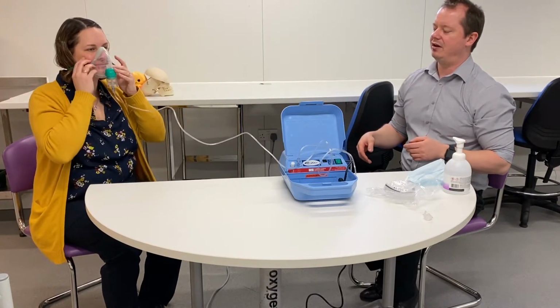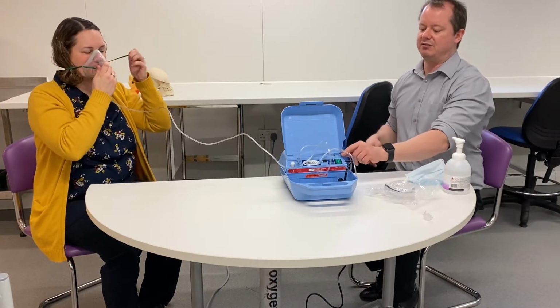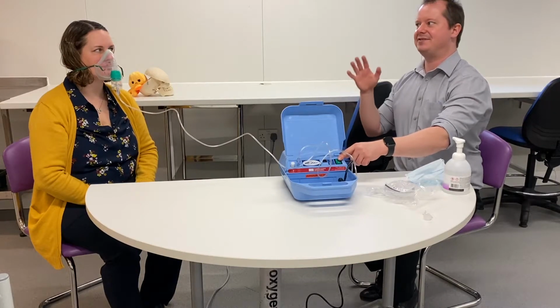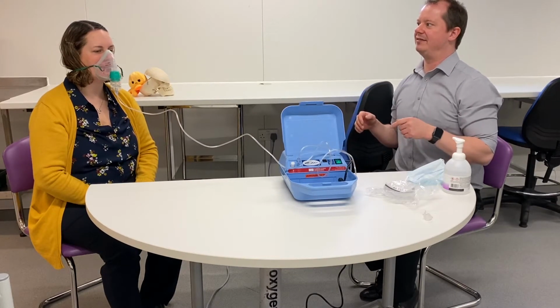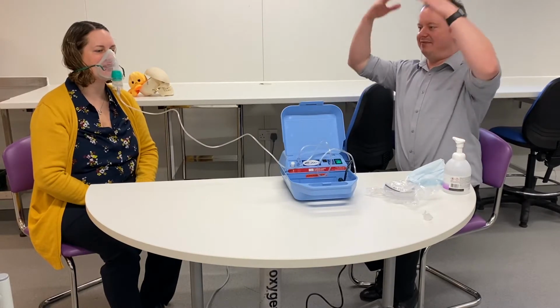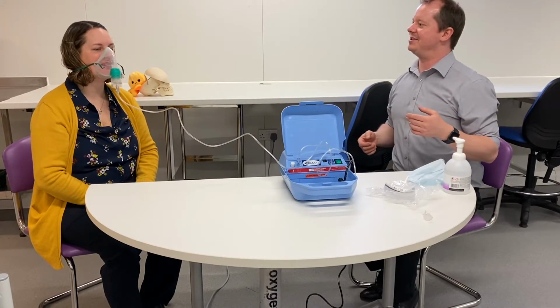Once it's on, I'll turn the nebulizer on, and hopefully you'll be able to see some puffs of vapor coming out. There you go. So she's going to feel her airways open up, and she's going to feel so much better now.